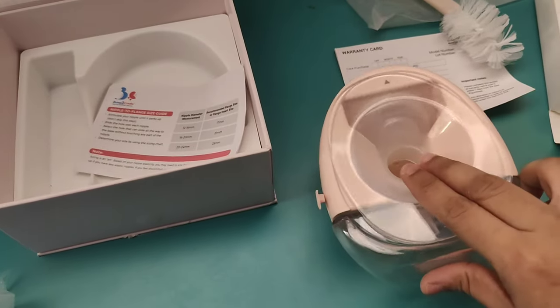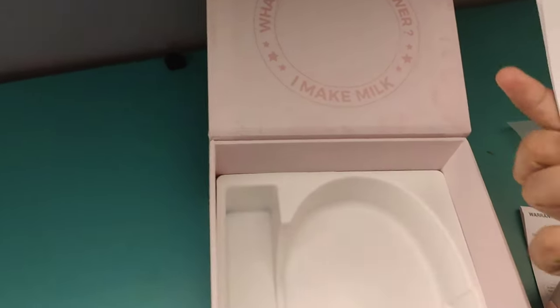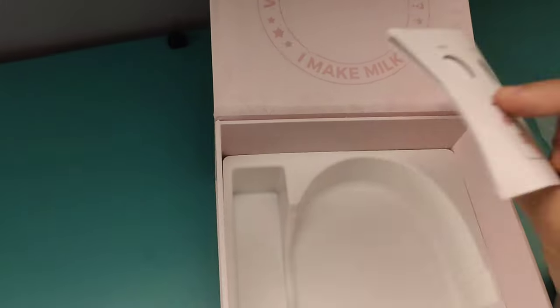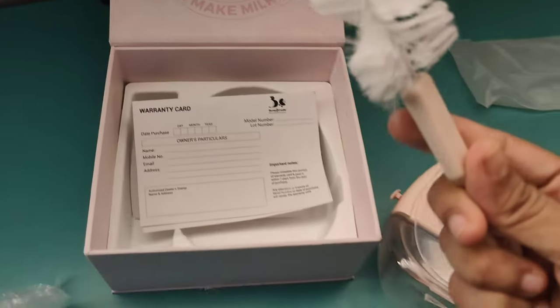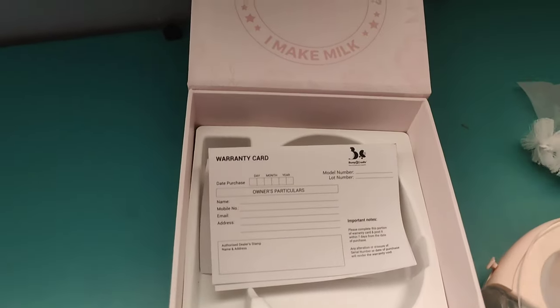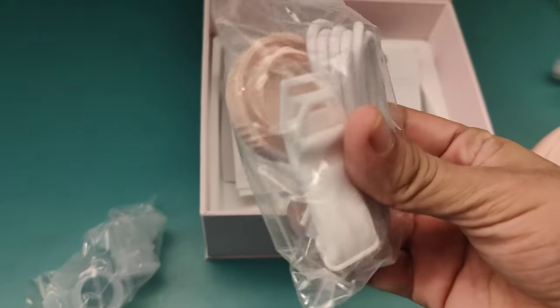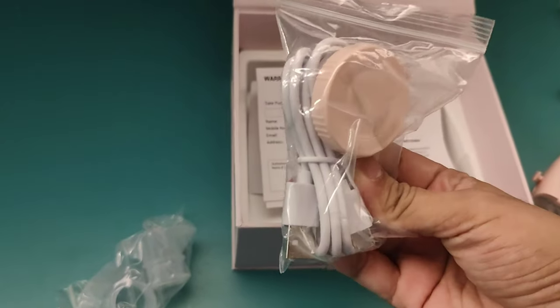We can remove this protective cover. After that, we have to use the warranty card — this warranty card is always good to keep. You can also clean the pump easily. Along with this, there is a protective strap. You have to connect the wires and charge it — it is chargeable.